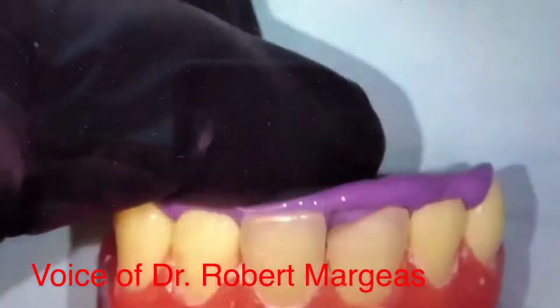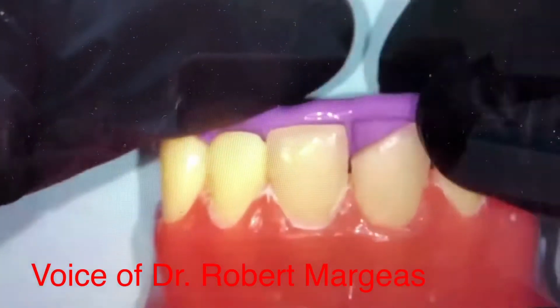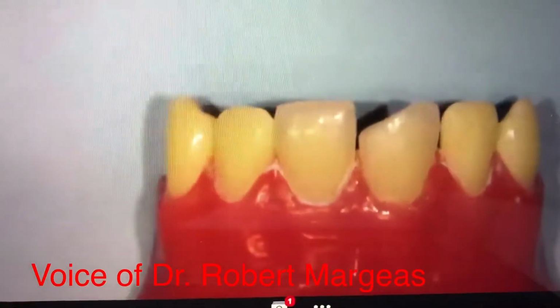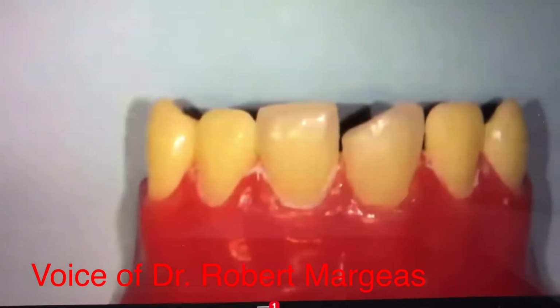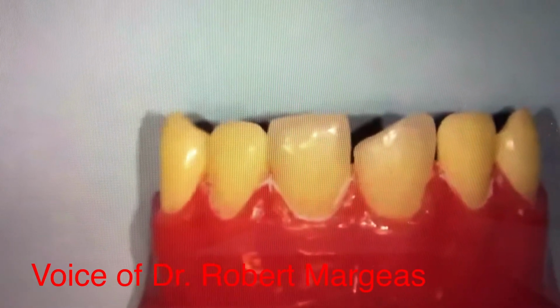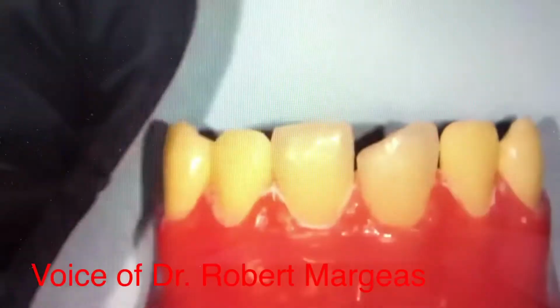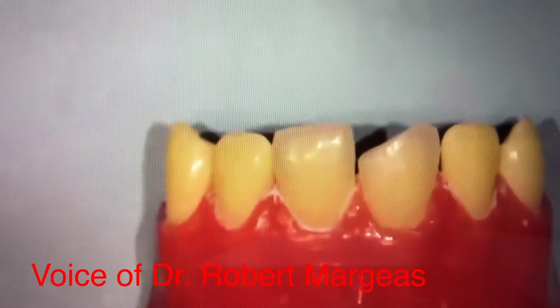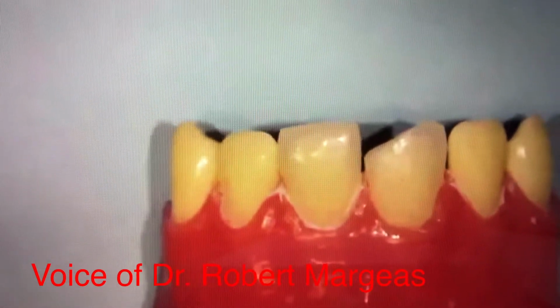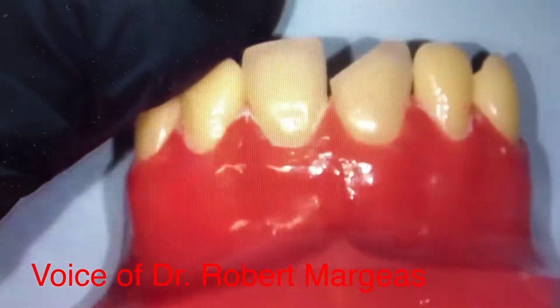I'm going to do a bevel, and then I'm going to score this lingual. The important thing about the bevel is you want to make it long and deep enough so that we have the ability to hide that margin. It's really, really critical to be able to hide that margin. So I'm going to take my flame-shaped diamond that is in the kit, and I'm going to start to bevel my tooth.